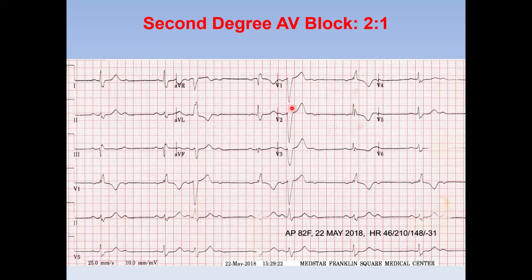So this patient has really bad conduction system disease. It has both right bundle and left bundle branch block alternating. If you look suddenly, one may think there is AV block with PVC, but you have to look at this very carefully. It's actually conducted, because the PQRS relation is consistent.